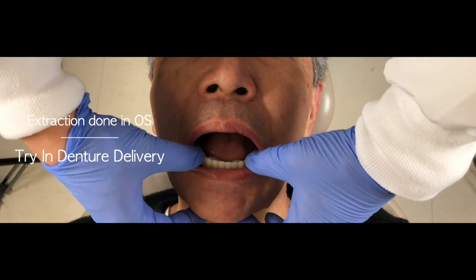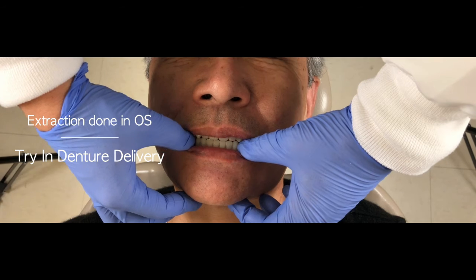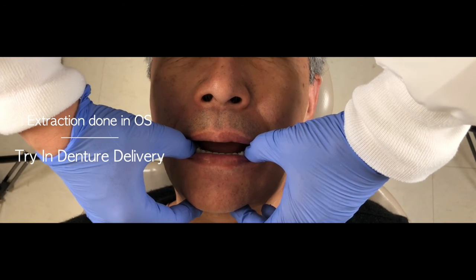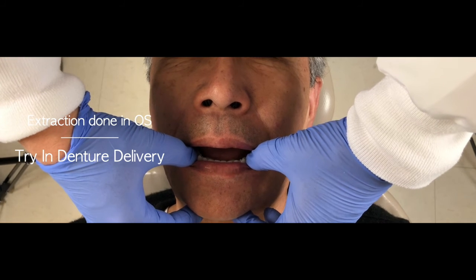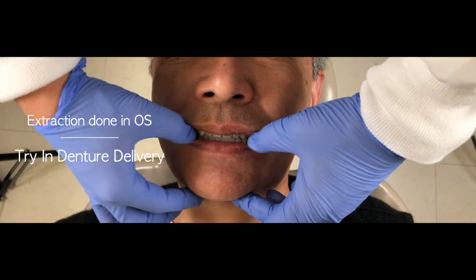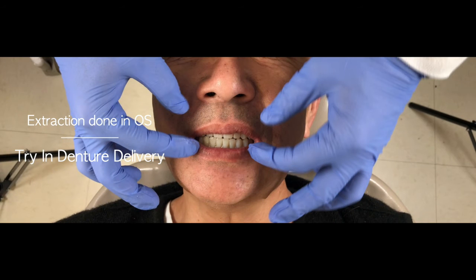You may need some adjustment on delivery if there's some tissue undercut. And after you deliver the denture, you also need to check the occlusion as is shown here.